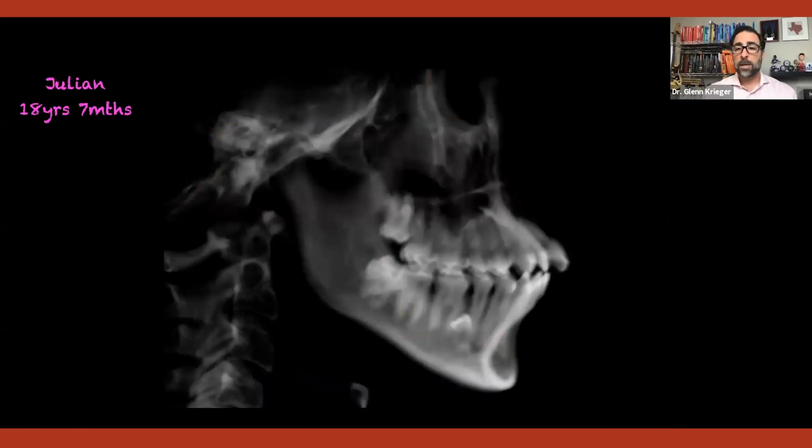Again, Julian was a virtual consult in my office. I told you, these are recent images all in a row. Julian was a virtual consult in my office that I ultimately brought in before we were shut down. I did a virtual consult and then brought him in to do a CBCT to do a real final exam. And this is where you need to be careful with virtual consults, because he showed me his teeth and I saw everything and I said, looks pretty good. Here's what I think we're going to do. And I always say think, but I need to get you in for a CBCT to go look at things.